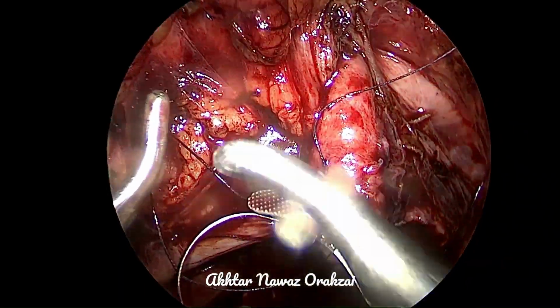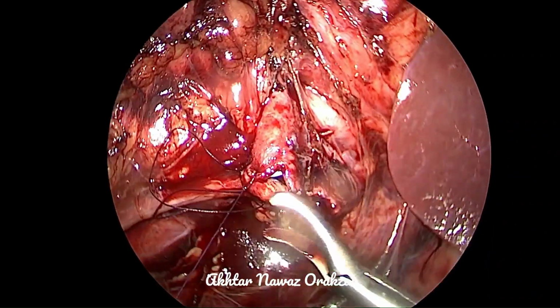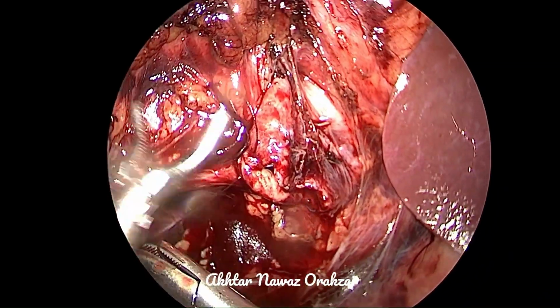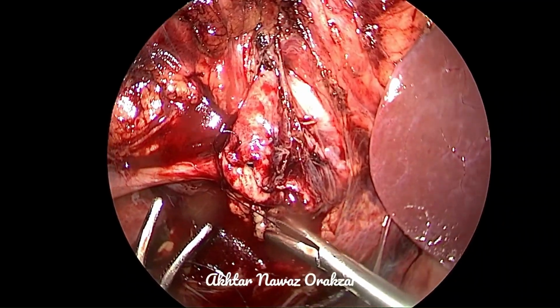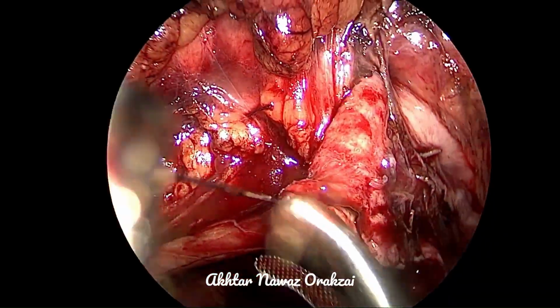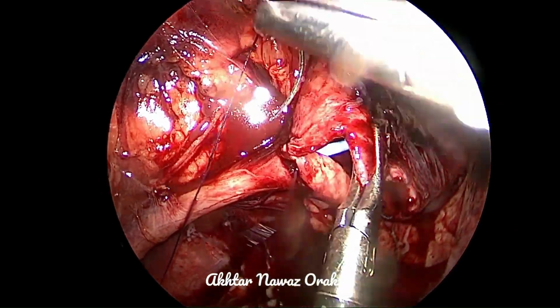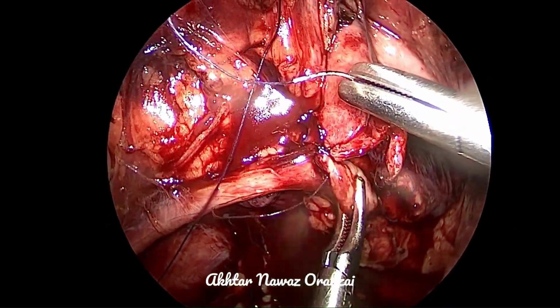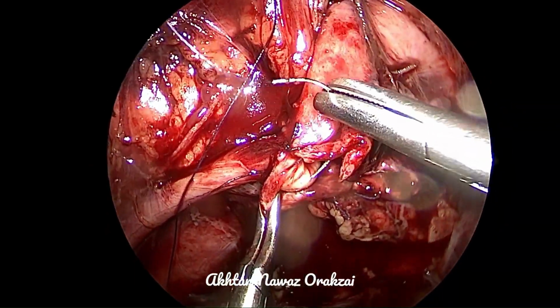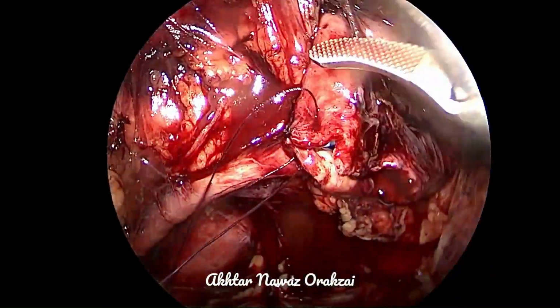Because we have seen a few cases where the stent has been taken into the stitch, and then at the time of removal of the DJ stent, one only knows that it has been stitched, and then it becomes a big problem. Then we remove it through a percutaneous procedure. But even then, if it is taken in the stitch, it is embedded in the mucosa. At times it needs another surgery that may be open or laparoscopic. So fine stitches from the edges are taken.